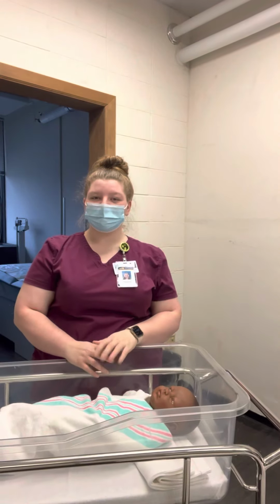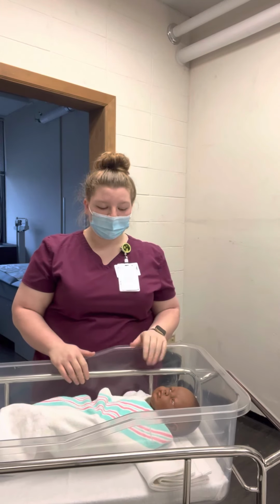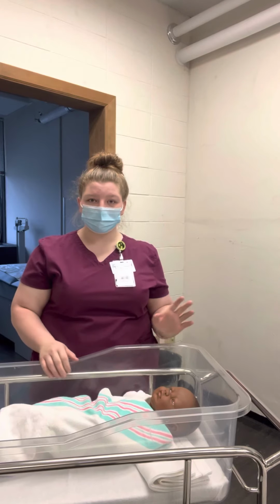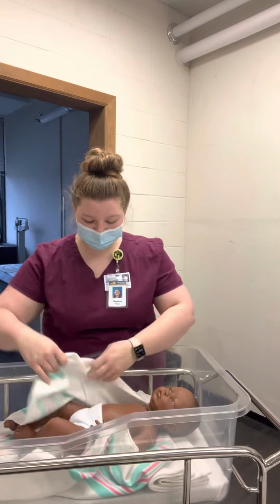My name is Cheyenne Purtee, and I'm going to be doing a pediatric medication administration today. I'm going to be following my general safety principles and practices throughout the entire procedure. So to start, I'm going to show you the IM injection sites.